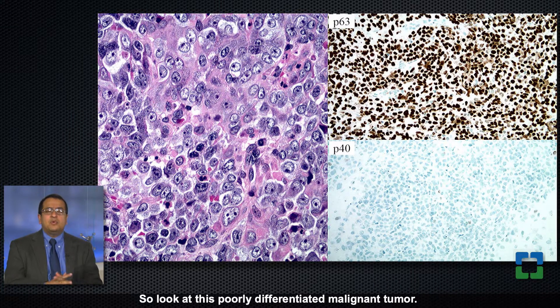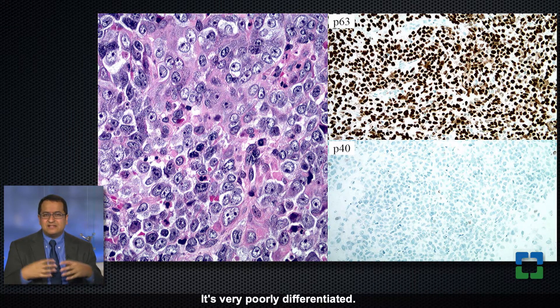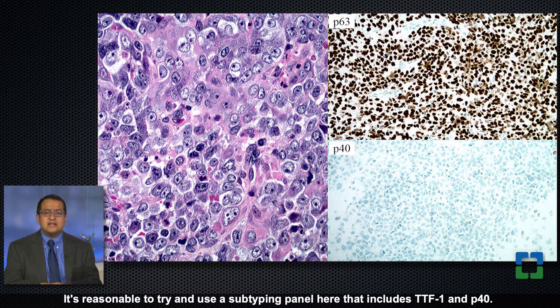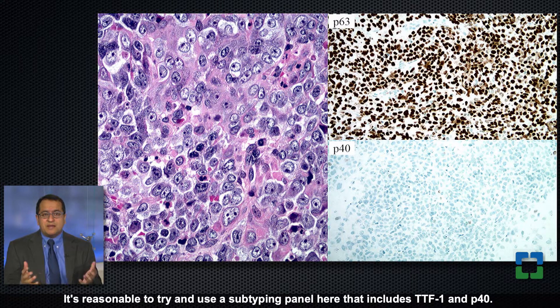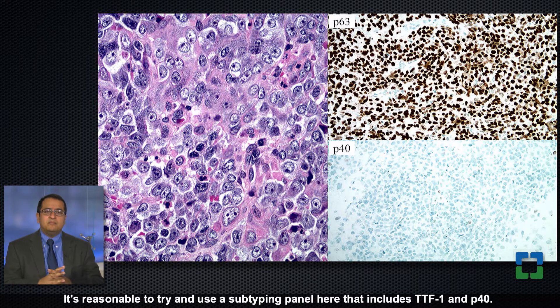Look at this poorly differentiated malignant tumor. It's very poorly differentiated — there are no glands, no keratinization. It's reasonable to try and use a subtyping panel here that includes TTF1 and p40.